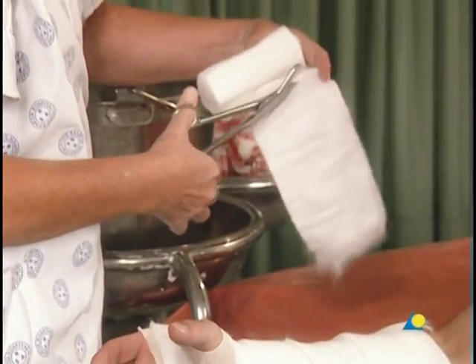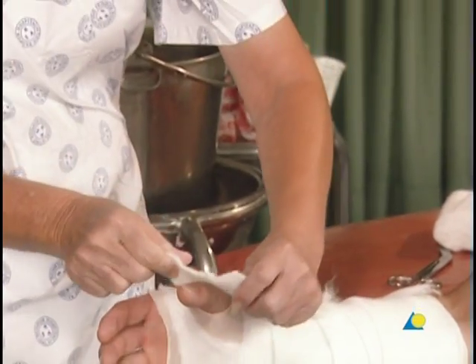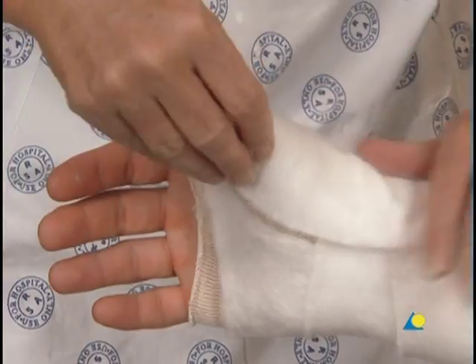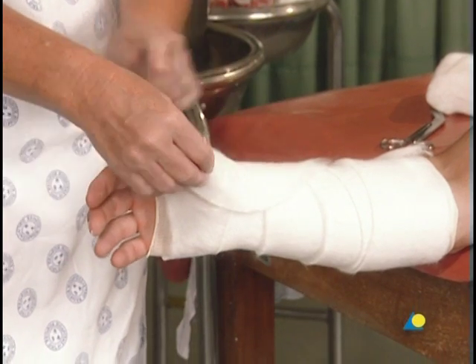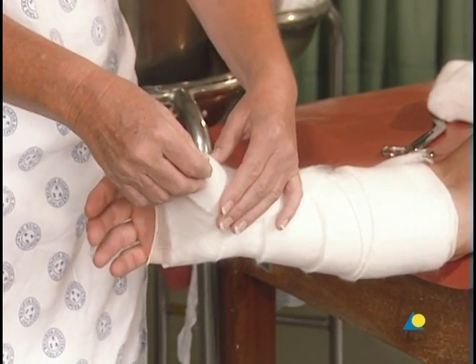An additional piece of cotton wool is cut from the roll and placed over the thumb, as shown. This material will also protect the styloid of the radius and the base of the first metacarpal from pressure points.